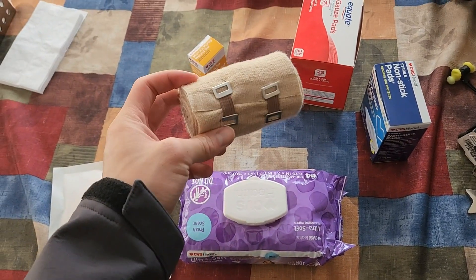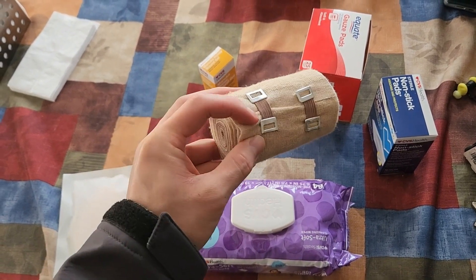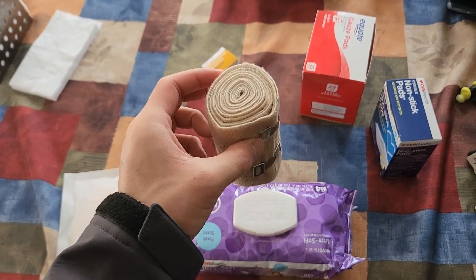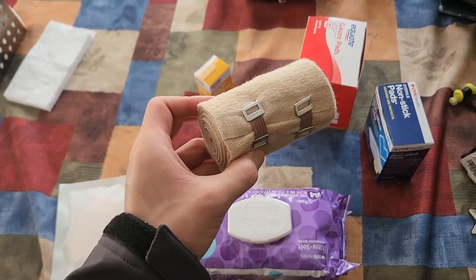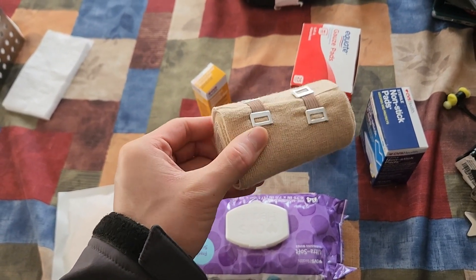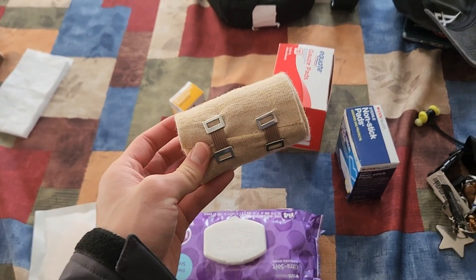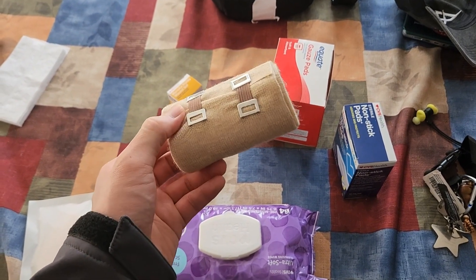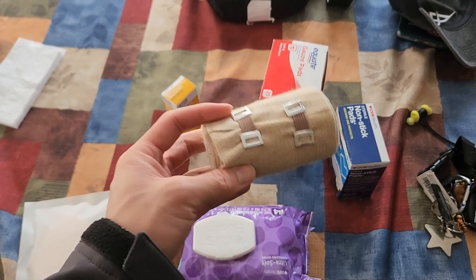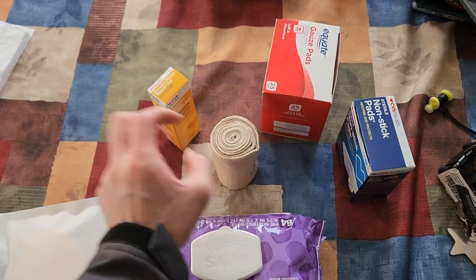To start, I have a reusable bandage. To use it, just wrap it around, make sure it's at an appropriate tightness, and use the latches to secure it. To wash it, you can either rinse it with cold water and dish soap and let it air dry, or put it in the washing machine on a cold and low tumble setting, then air dry or use the dryer on a low or no-heat setting to preserve the elasticity.